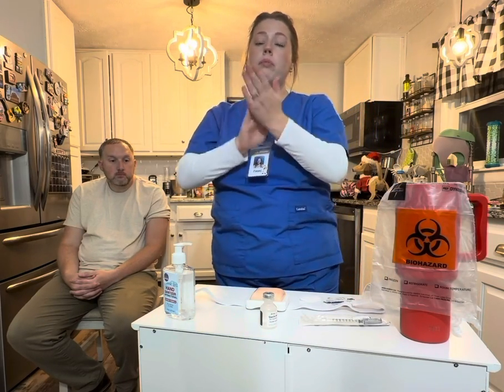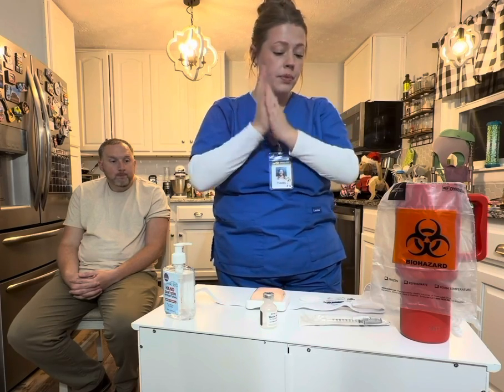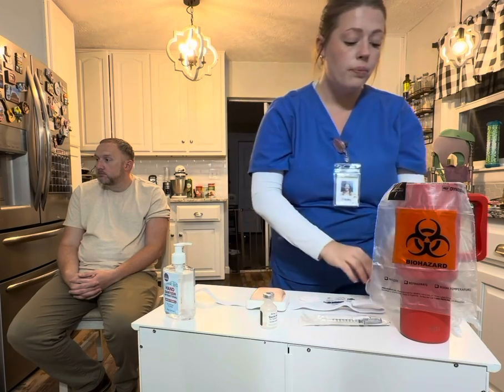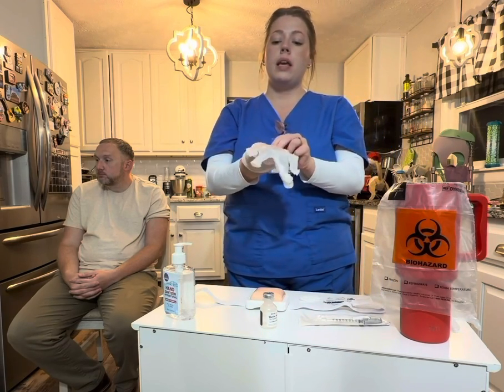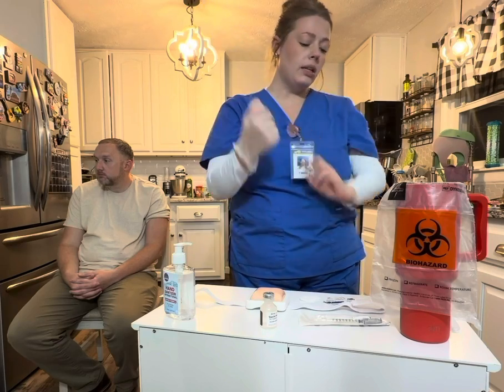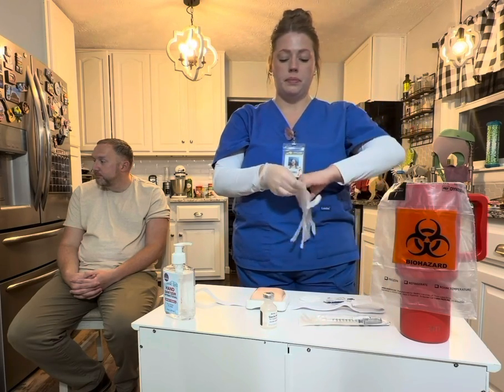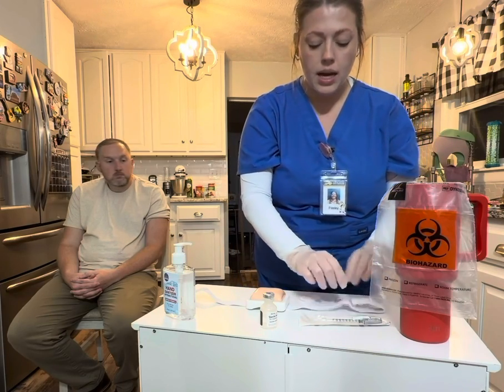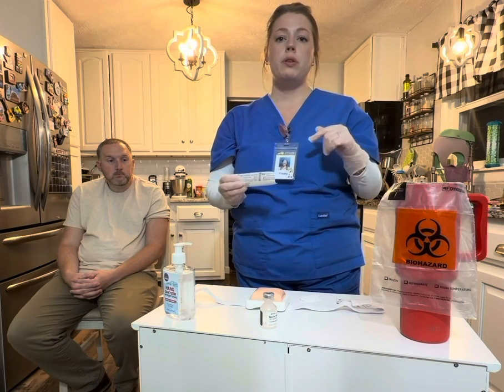So we'll go ahead and perform hand hygiene. And then I'm also going to be demonstrating how I would draw up medication from a vial. So then I would go ahead and put my gloves on. And then I'm going to be using a 27 gauge by 1/2 inch. So for subcutaneous, lengthwise, you can use anywhere from 3/8 to 1 inch in length. And you can use a gauge anywhere from a 30 gauge to 25 gauge.